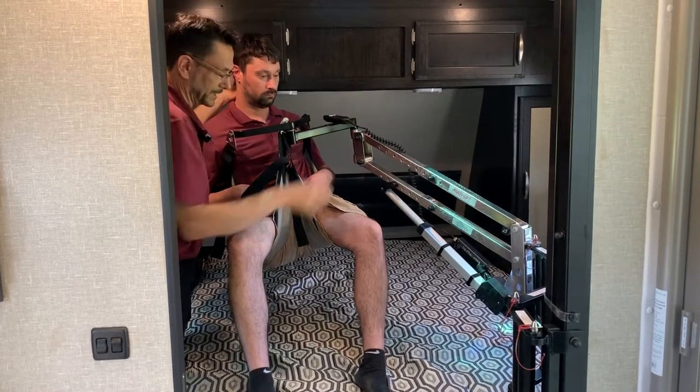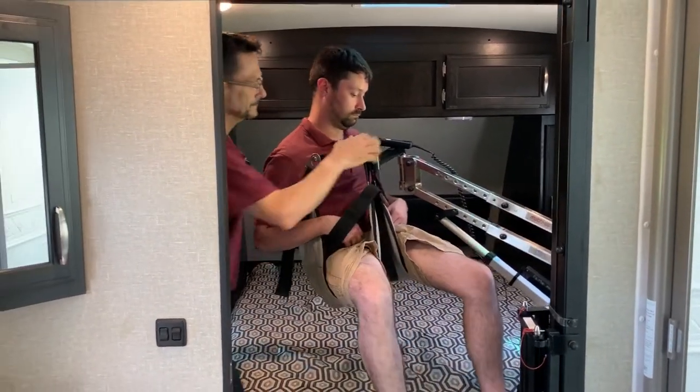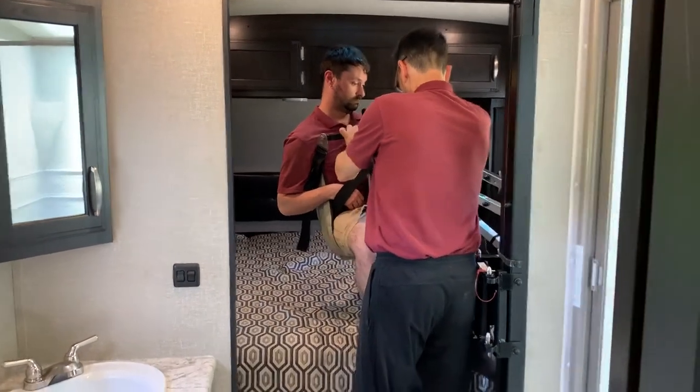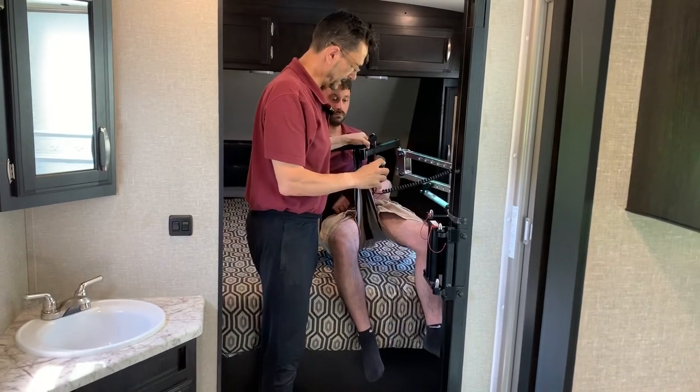You'll notice that the side-to-side motions are very easy. We can move the person to a different part of the bed, sit on the end of the bed, get a little support, have a chat — anything is possible.